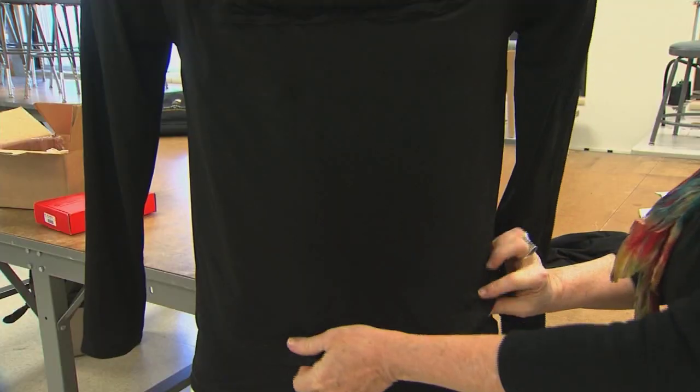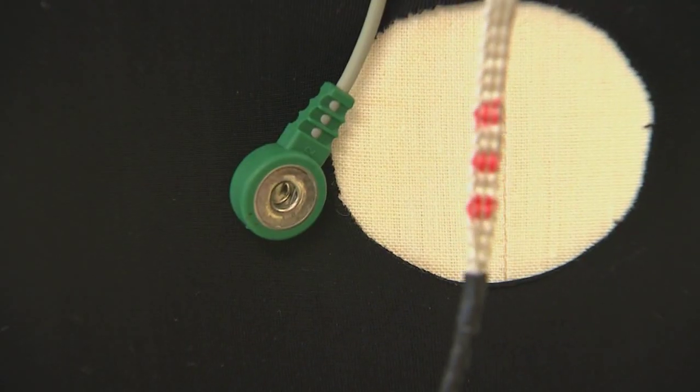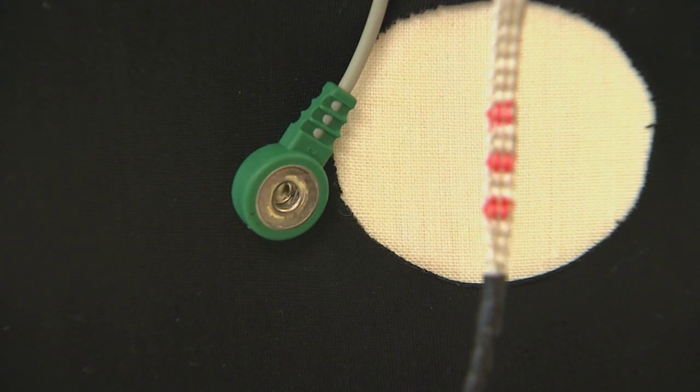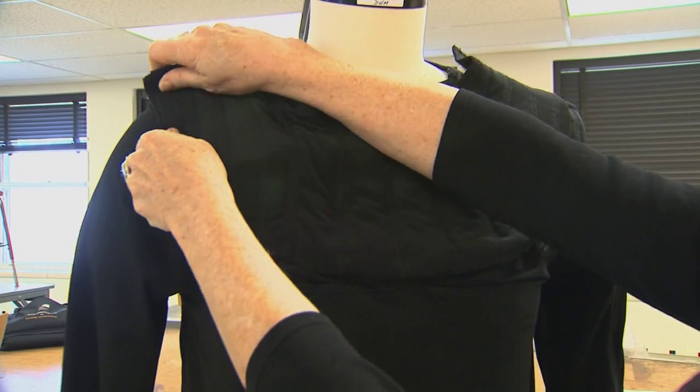So if you're a patient that has significant sleep apnea, you're susceptible to congestive heart failure, hypertension, left ventricular hypertrophy, all sorts of cardiovascular problems. So if we can understand what's going on in your body during sleep apnea, that will help us for early prediction of all these other diseases. Dr. Benjamin says catching those diseases early makes them much more treatable. A sleep study in a hospital costs around $2,000. The vital signs monitoring shirt could cost as little as $300 to $400.